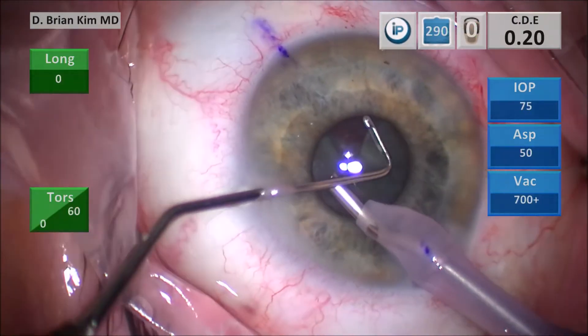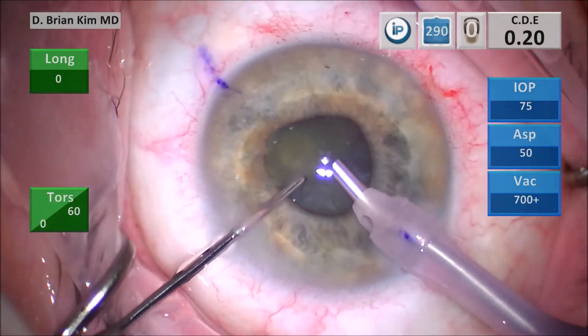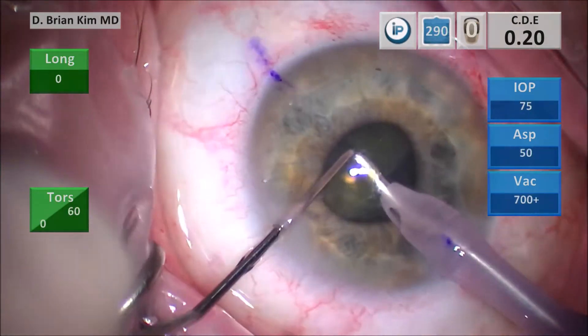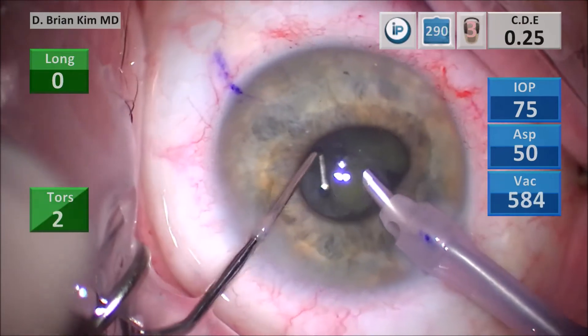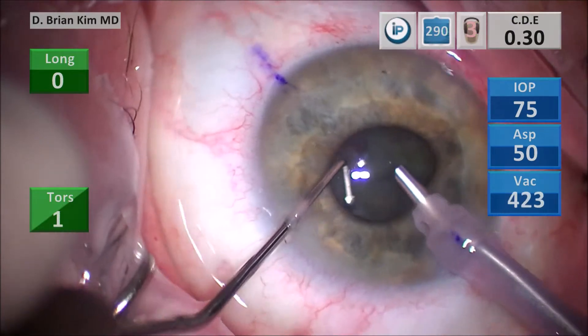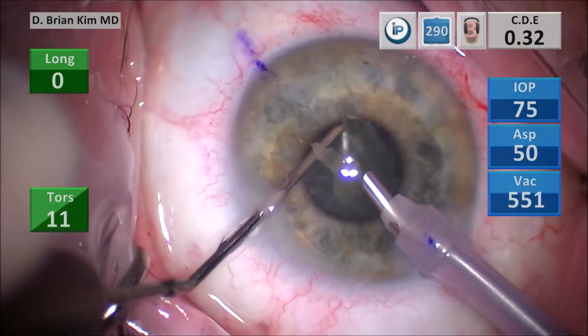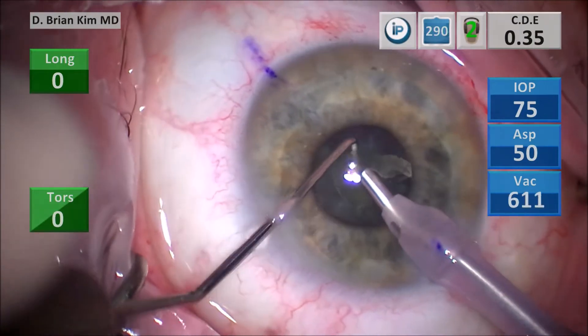I use the chopper to bring the pieces out of the capsular bag very nicely, bringing the lens material into the central safe zone. I use mechanical forces to break the lens into small pieces, and then when I'm ready, I emulsify using the ultrasound and vacuum.